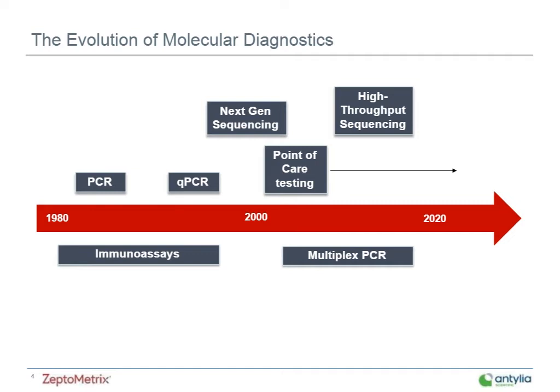And though multiplex PCR had been around for several decades prior to this, it really didn't rise to prominence until the early 2000s. Obviously, using multiplex PCR panels helped meet laboratories' needs for high sensitivity and specificity and quicker turnaround times. But these methods were also typically beneficial in terms of cost for training of laboratory staff and to implement uniform workflows in the laboratories. Importantly, multi-pathogen panels allowed the co-detection of species that had previously been incompatible to grow in the same culture systems. So you can see how this kind of testing was really a game changer in the field.